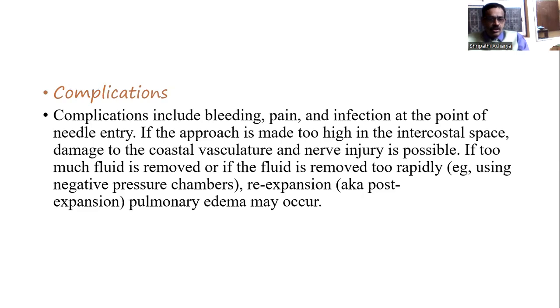The complications include bleeding, pain, and infection at the point of needle entry. If the approach is made too high in the intercostal space, damage to the costal vasculature and nerve injury is possible. If too much fluid is removed, or if the fluid is removed too rapidly, for example using a negative pressure chamber, there is a risk of re-expansion pulmonary edema.